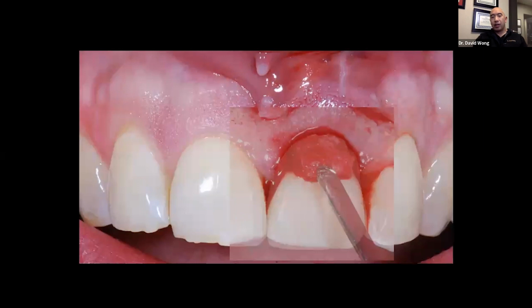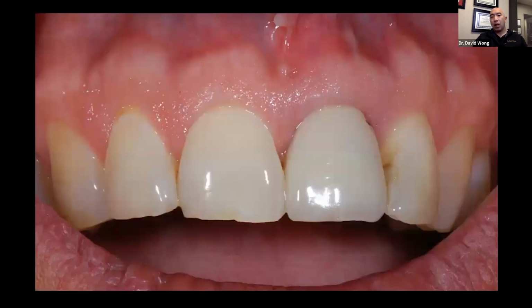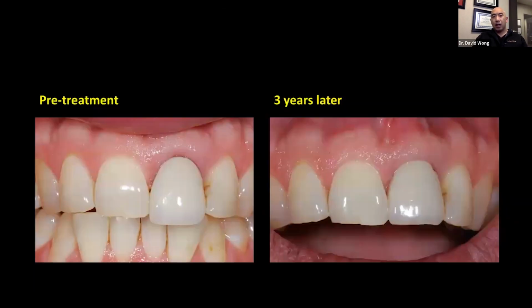And then just to top things off, to minimize any extra shrinkage, because if you have taken my hard and soft tissue classes before, you would have heard me say that even with perfect socket grafting, you're still going to, on average, lose about 20% of your buccal-lingual bone width. So that's why, on top of all these aesthetic cases, we'll also add a little bit of soft tissue. Here we can see how the soft tissue is healed very, very nicely.